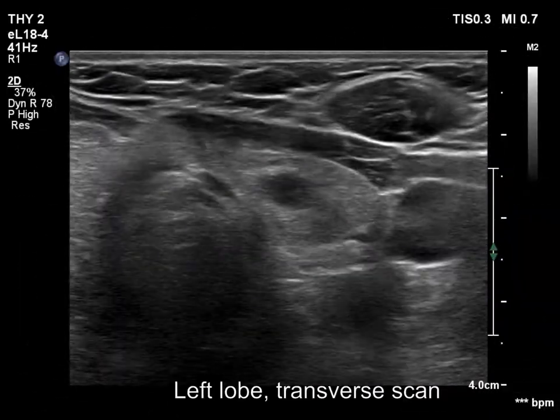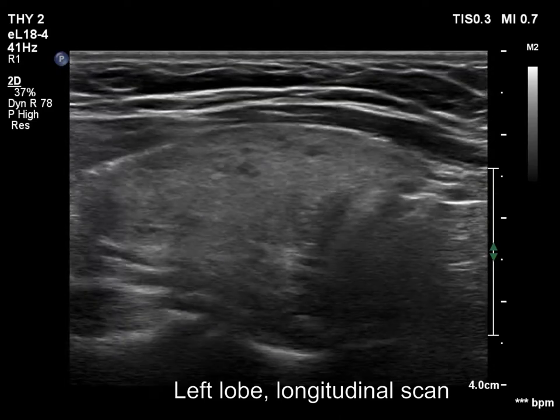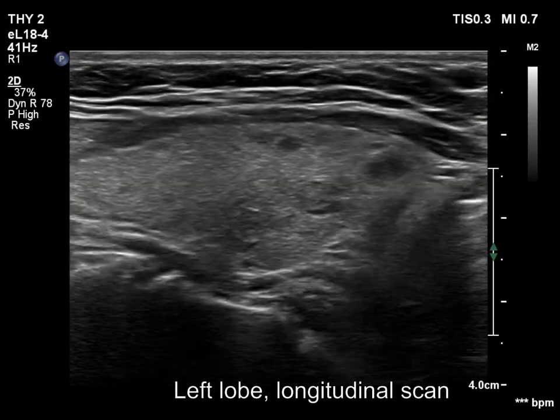The discrete areas in the left lobe can be considered as more active foci of thyroiditis. The other one is also included with the thyroiditis.